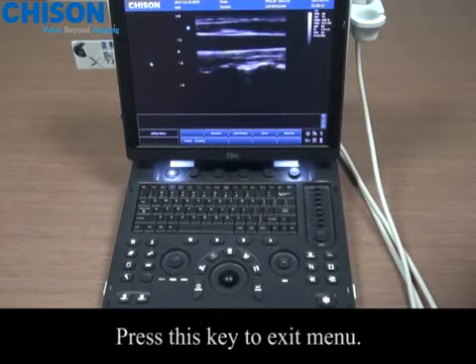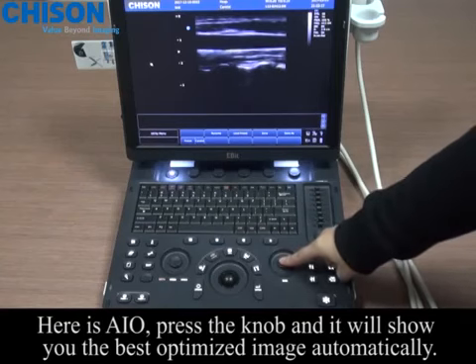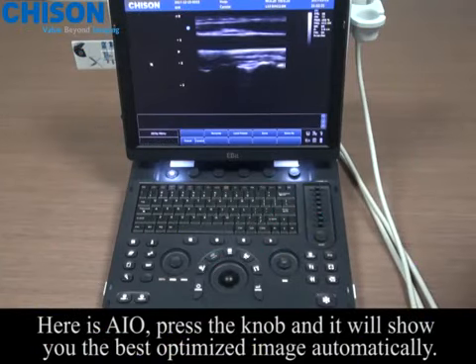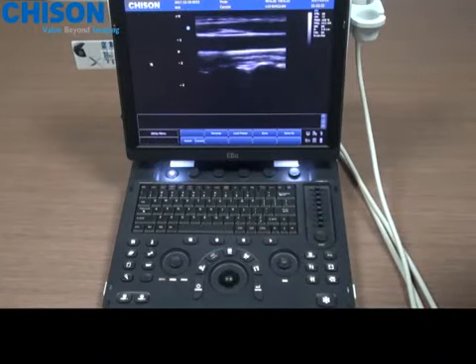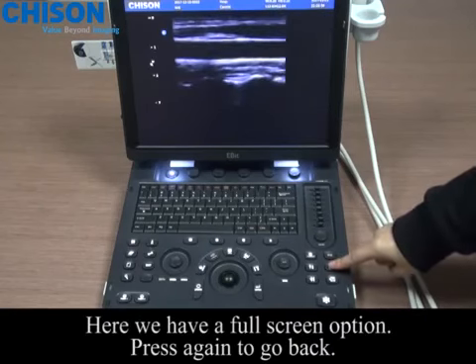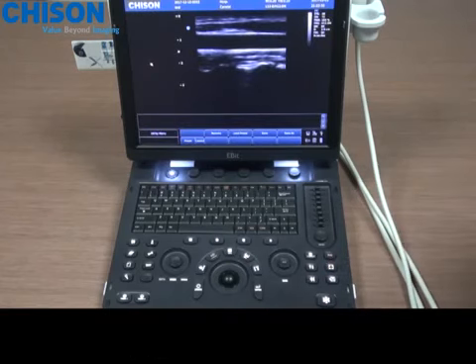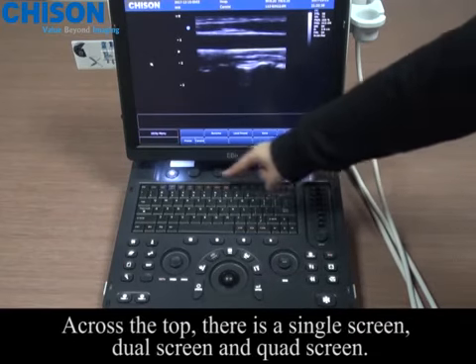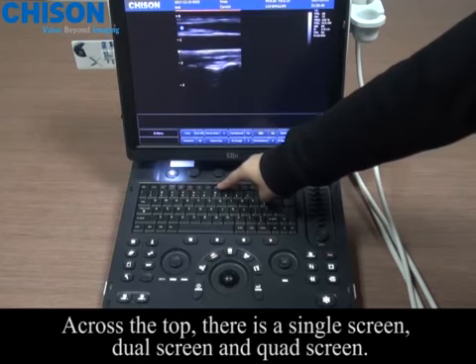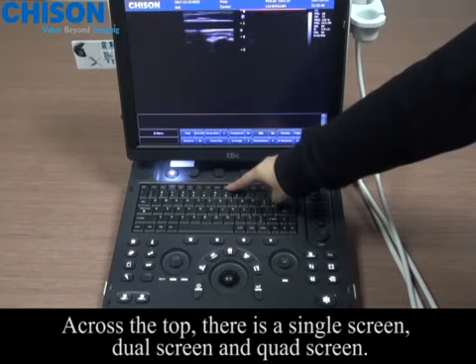Press this key to exit the menu. Here is AIO — press the knob and it will show you the best optimized image automatically. Here we have a full screen option. Press again to go back. Across the top, there is a single screen, dual screen, and cine screen.